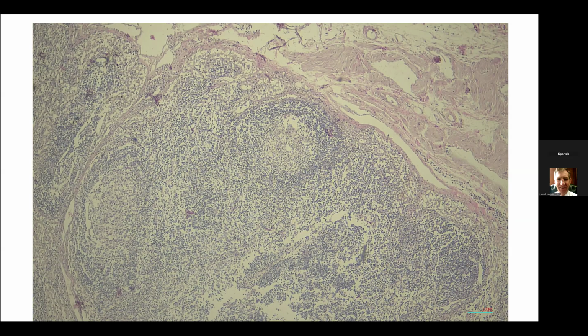Now, to confess, the fresh sampling of these solid areas actually missed some of them. Going back and remembering how ovarian tumors need to be sampled, especially taking about one sample per centimeter, that caused me to go back and do a thorough sampling.